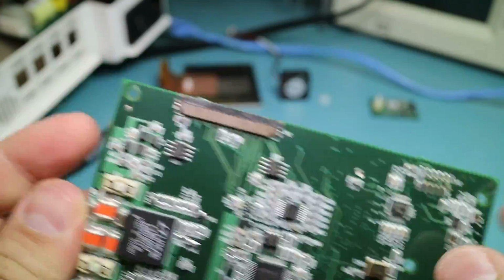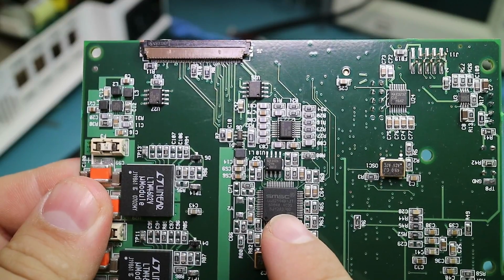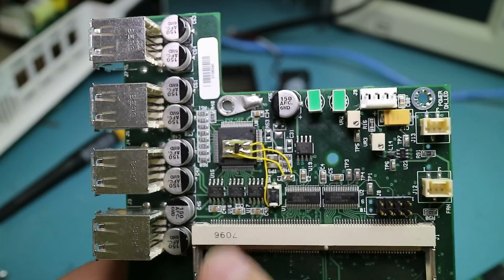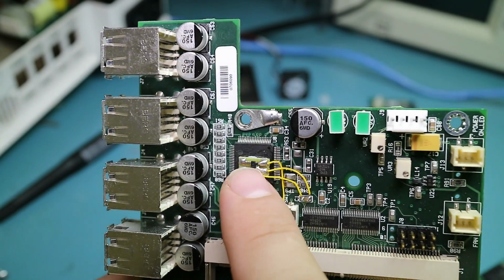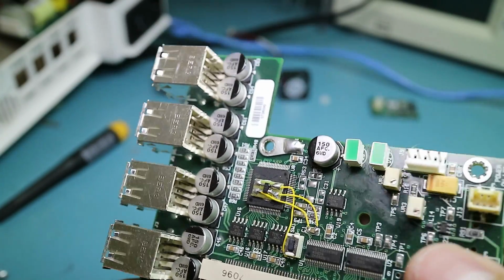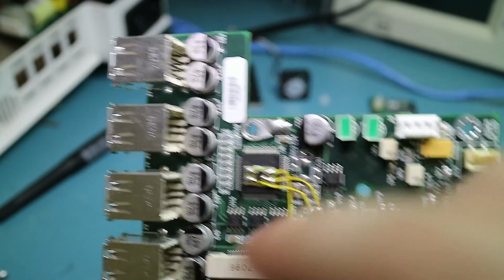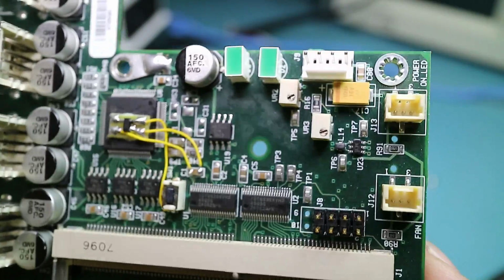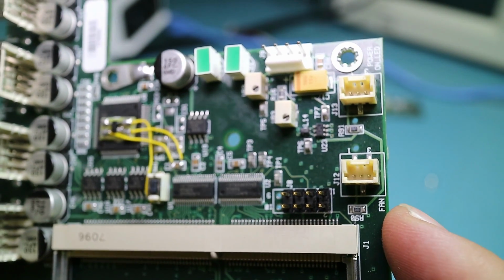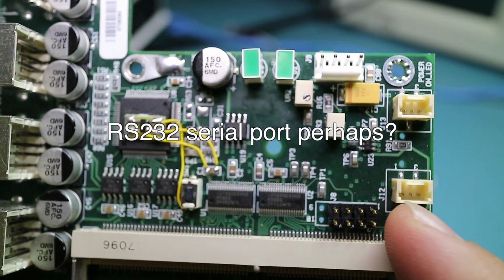Anyway, we've got a few crystals on here. There's one down here and one up here. And we've got some odds and ends, probably drivers for the LCD, which, you know what, this might actually be an LCD driver of some type. But going over here, this actually might be the USB hub, but it's got this crazy bodge on it where it's got a small piece of PCB with a 4-pin SOT23 device on it, and a little reset switch, and some small components which are probably stuff like protection for the USB ports. These are a couple trim pots. There's some LEDs which aren't actually used because they're using that extension wire to take it out to the case. Power on LED, fan, and this appears to be some kind of programming header or possibly another USB port. I'm not 100% sure on it.